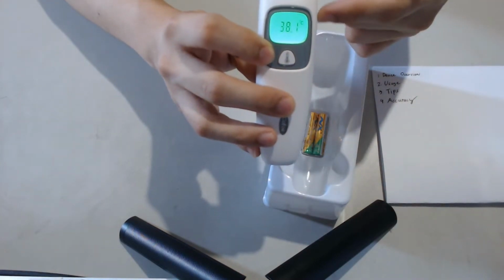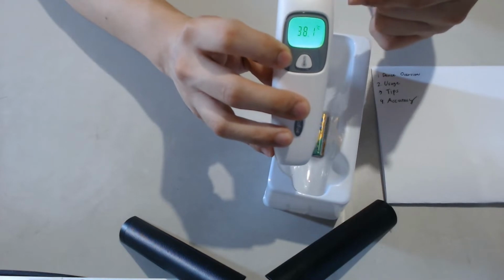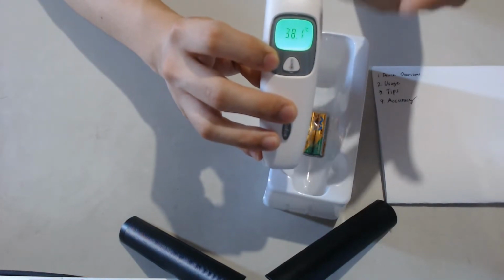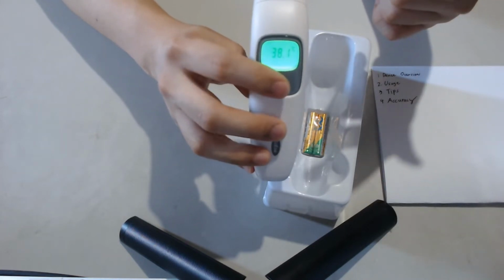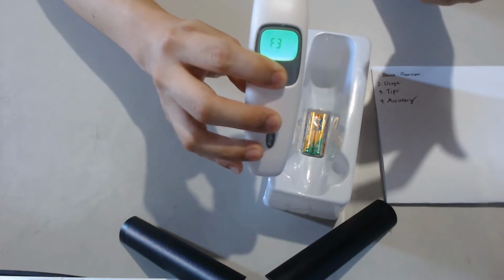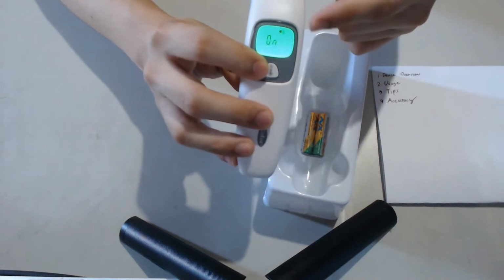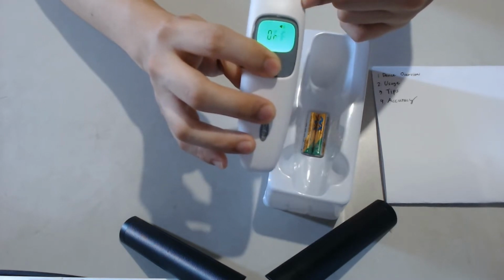This one will change the threshold for a fever. In this case, if it's 38.1, it will display red, like, oh, I have a fever. I can change it by pressing a single button. Next, F3. This is whether I want the sound to be on or off.